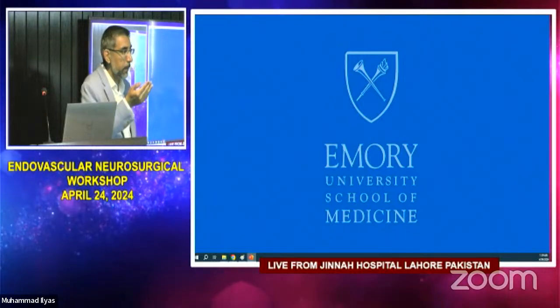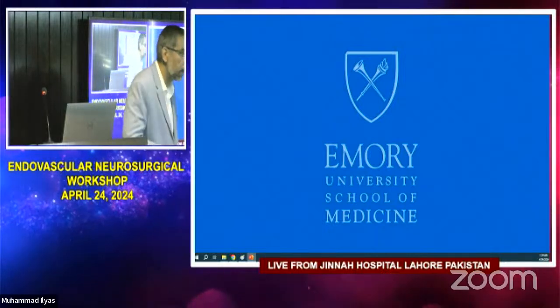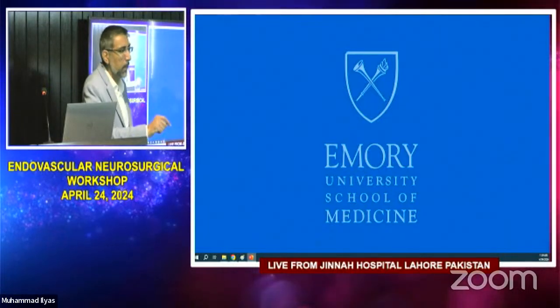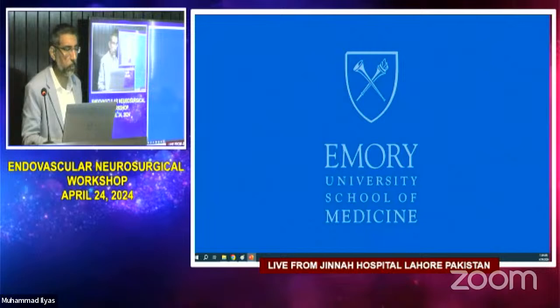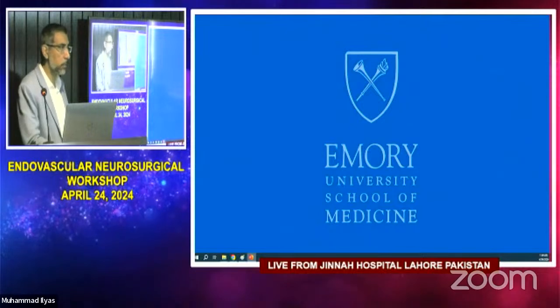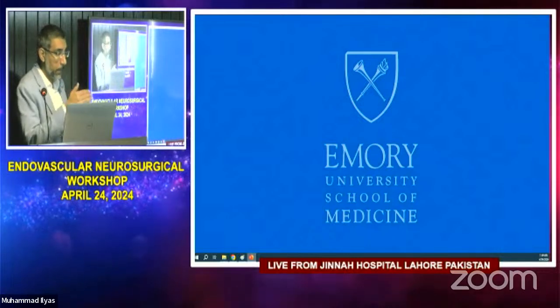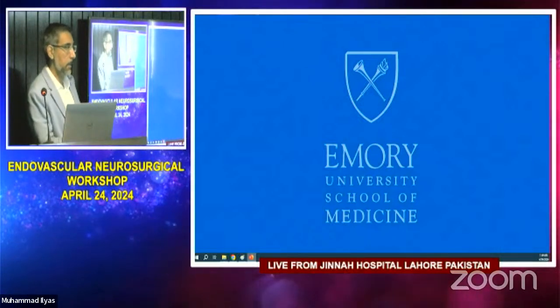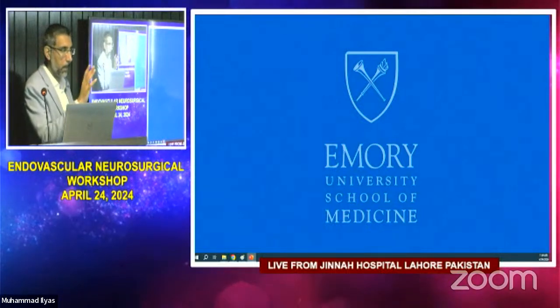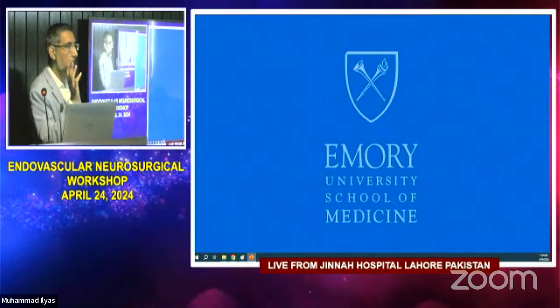And then a couple of AI softwares came into being. One is Rapid AI. Rapid is an Israeli technology. The other AI, I think, is from Germany or something. What happened is that now the AI software is on my phone, right? If a patient comes in with a stroke, they get a CT, CTA, CTP, and as soon as the CTP is done, the artificial intelligence software will analyze it, and if it finds a big penumbra and a favorable core penumbra ratio, that thrombectomy should be done, the software automatically sends an alert to me and my staff who are on call.